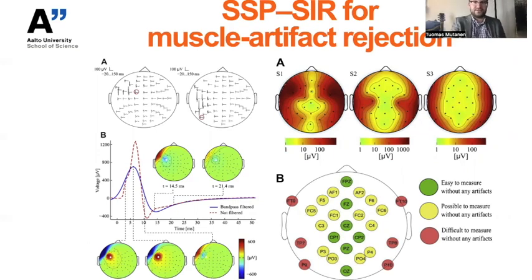We can see here that those responses are especially bad on the lateral parts of the head, and also from this traffic lights image, we can see that whenever we stimulate regions closer to the muscles, the problems get elevated. Whereas in the vertex, the situation is much better. We can also on the left see that the muscle artifacts have this characteristic biphasic response, and the topography is coming from the lateral part of the head.